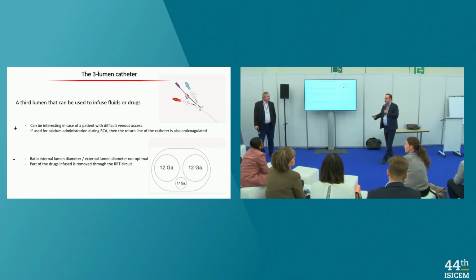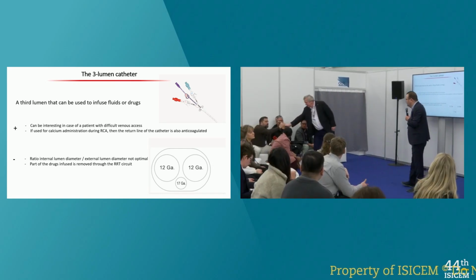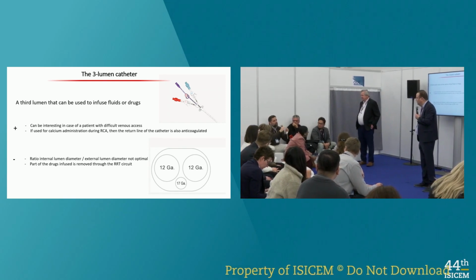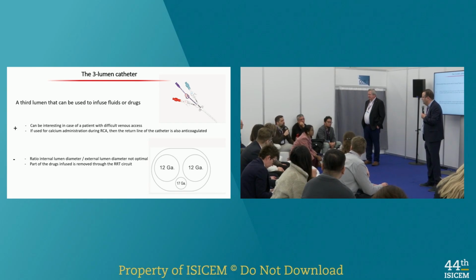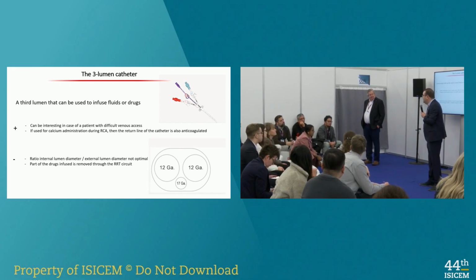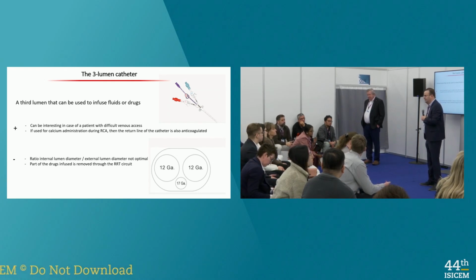I didn't answer your question about the one direction. In Brazil, the device name is Tego. It's a cap that you put. It's one directional, and it says that you don't need to put citrate or heparin or any lock. It's just saline. I've never seen these catheters in the ICU. It's only for chronic patients, I think, right? Yes.